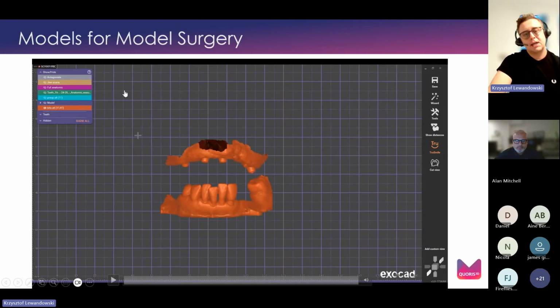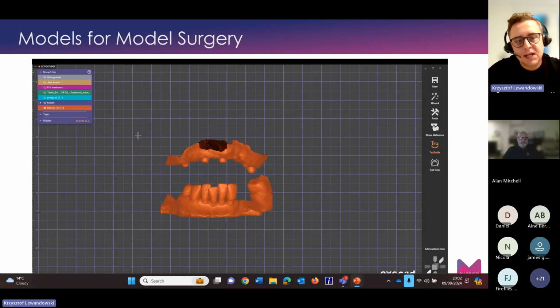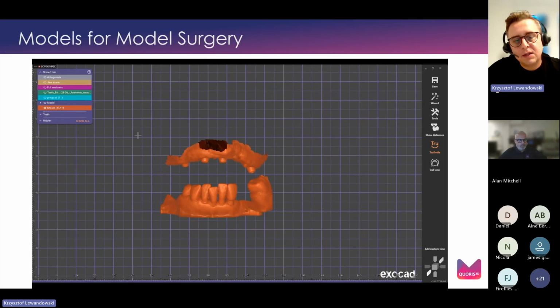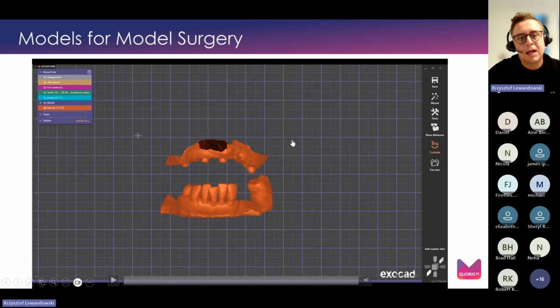The next stage was to manufacture the model surgery. We worked with this case a bit differently than the standard CHROME cases. We didn't manufacture any models up front. We worked purely from the dentist record, the dentist bite scan and all STLs provided.